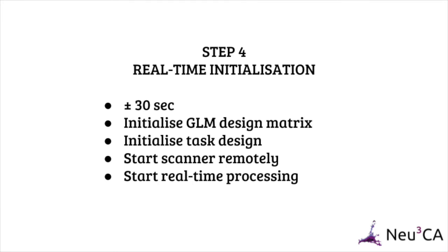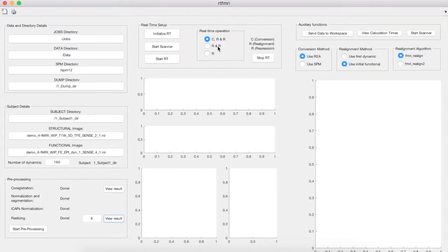Next comes the real-time initialization, just before real-time processing, which is very quick. We initialize the GLM design matrix, we initialize the task design, and we start the scanner remotely, and then we press the button to start the experiment.